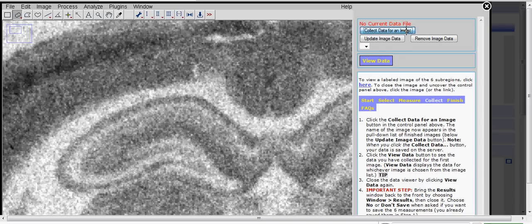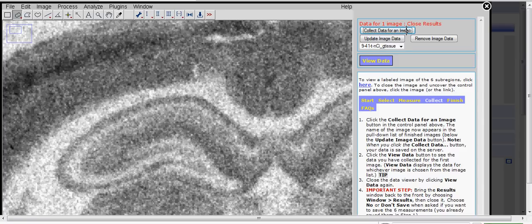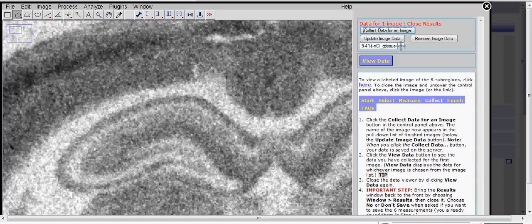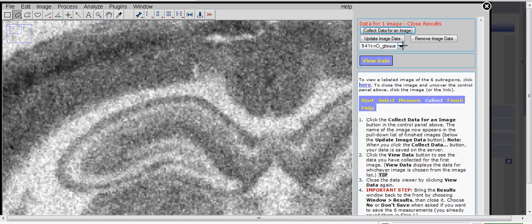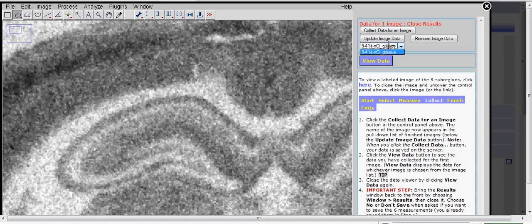If you want to see the measurements for that image or any of the other ones after you've collected them, you click on View Data and it'll open those six measurements you just made. You can close it by clicking on the measurements or on the View Data button again.